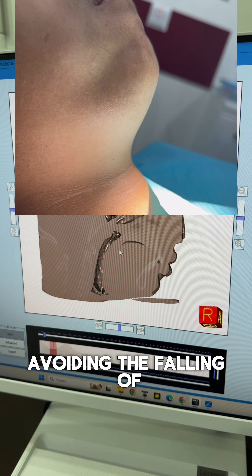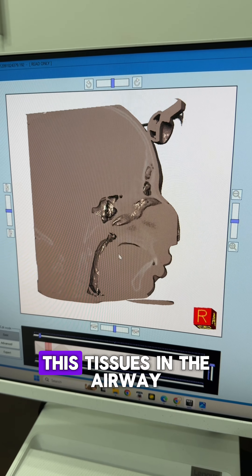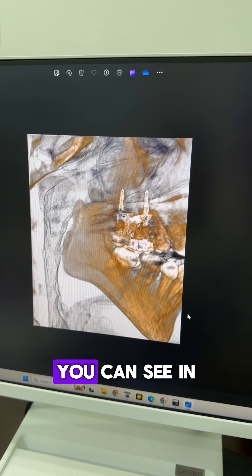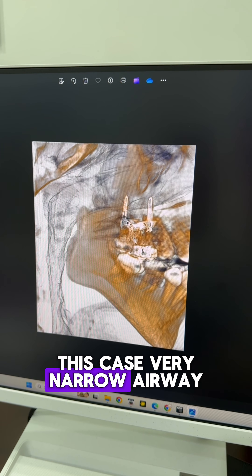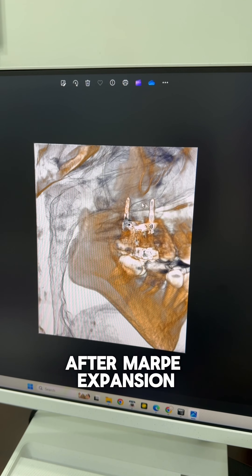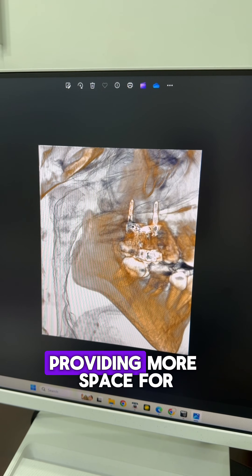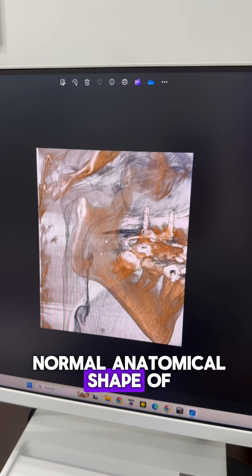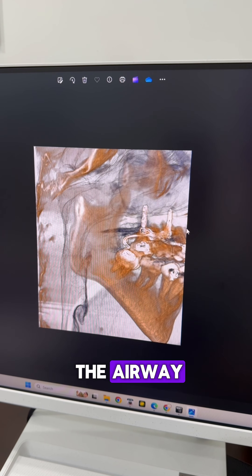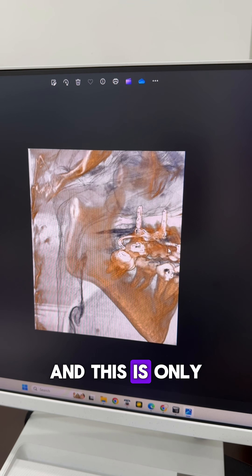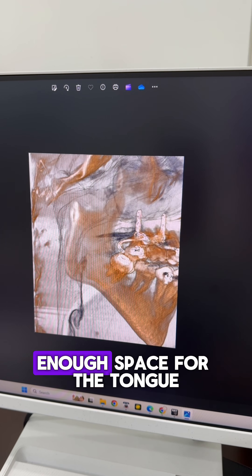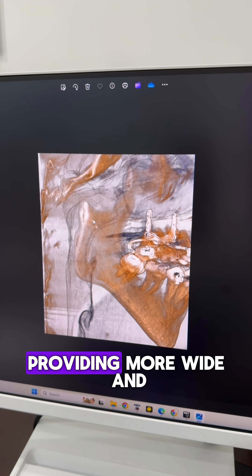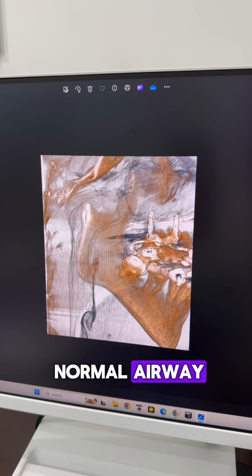This avoids the falling of these tissues into the airway, which causes sleep apnea. You can see in this case a very narrow airway. After MARPE expansion, more space is provided for the tongue — you can see the normal anatomical shape of the airway. This is achieved simply by providing enough space for the tongue, strengthening the muscles, and creating a wider, more normal airway.